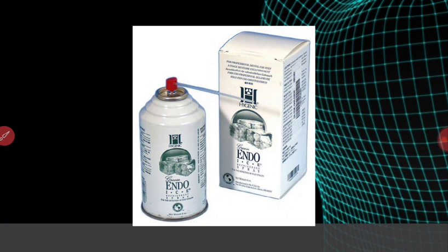So I believe the cold test is the most important test, and you should all have an Endo-Ice, whichever company you have. This is from Hygenic, and you should always have it in your armamentarium. It sorts out so many cases for me. And you just have to do a vitality test, and before you do it, explain the cold test to the patient.